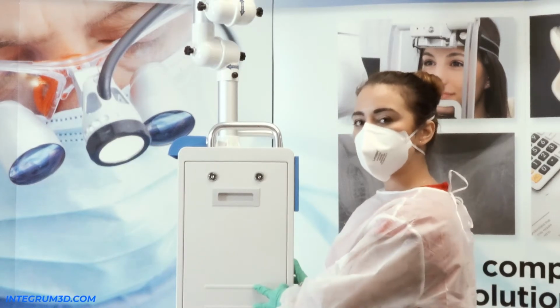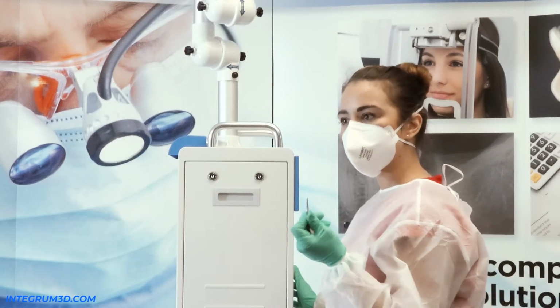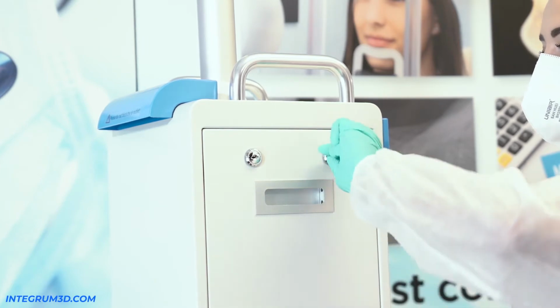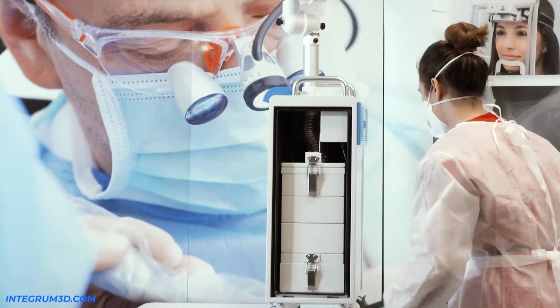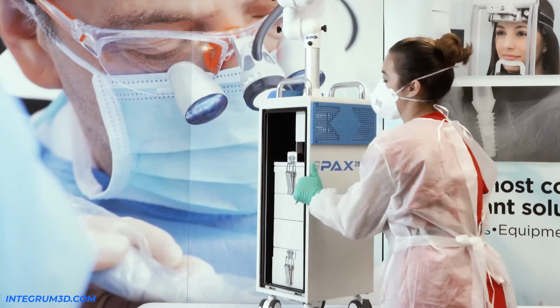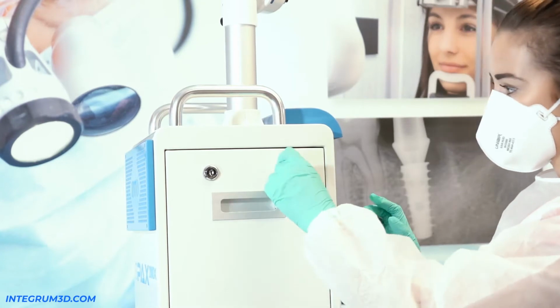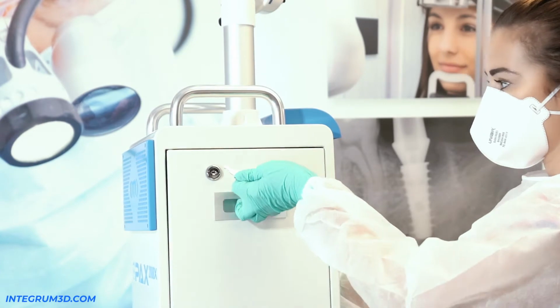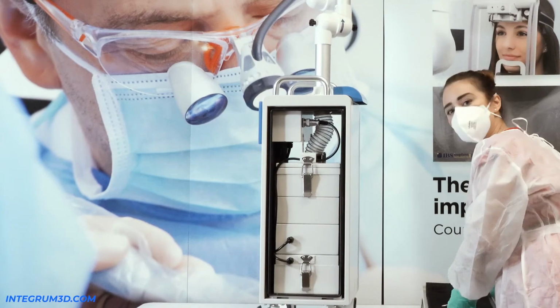To change your filtration system or your UVC light, use the key that your PAX 2000X came with to unlock both panels on both sides. We're going to remove the panel after we've unlocked this one. We're going to turn the machine to the other side as well. Take the panel off nice and carefully and put it to the side.